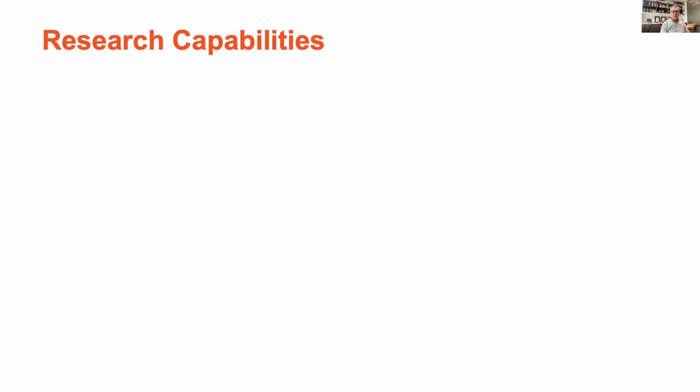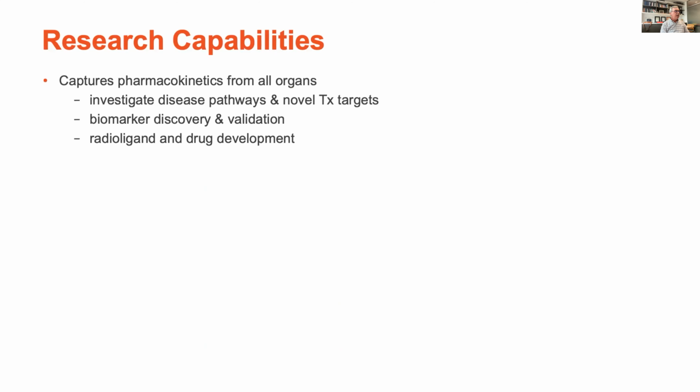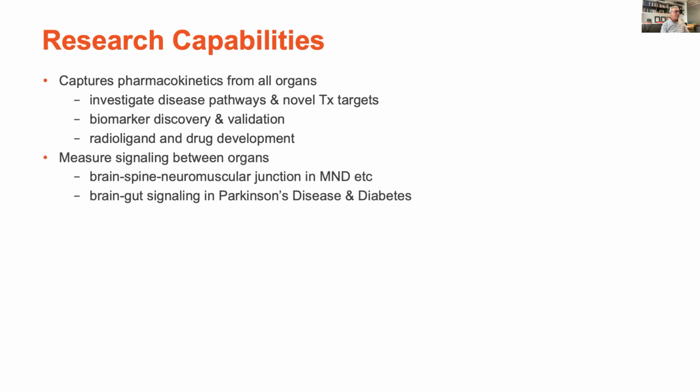I'll just run through some of the unique research capabilities that total body PET provides. I've talked about the ability to capture the pharmacokinetics of injected biomolecules from all organs. That means you can investigate disease pathways and novel therapeutic targets, do biomarker discovery and validation, and do radioligand and drug development.